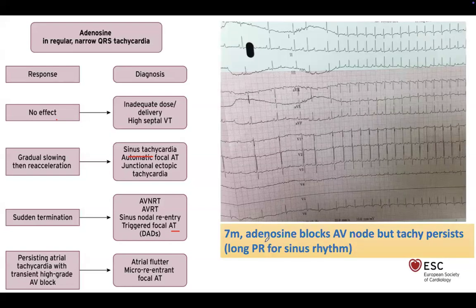So that's one example of a patient who had tachycardia as such. If you look at it, it looks like a sinus tachycardia. He was 7 months old, with a heart rate of roughly 170, resting, sleeping, not in distress, but a heart rate above what you would expect.